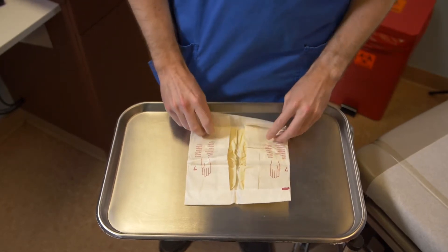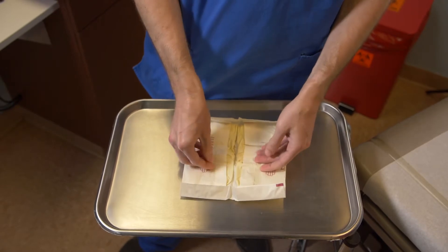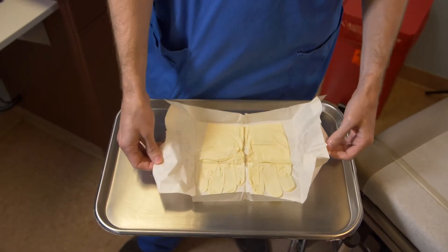Peel open the package being careful not to touch the sterile interior surface. Do not allow the gloves to slide between the sterile border of the package they are contained in. The gloves should be opened with the cuff end closest to you, the palms up, and the thumbs pointed outward. If the gloves are not positioned properly, turn the package around but do not reach over the sterile area.